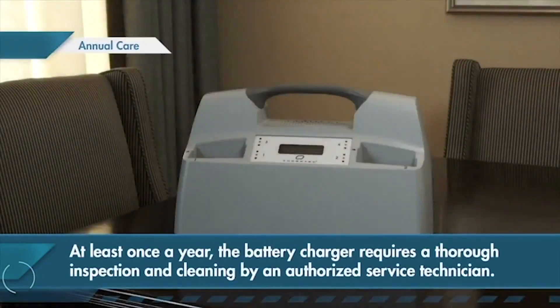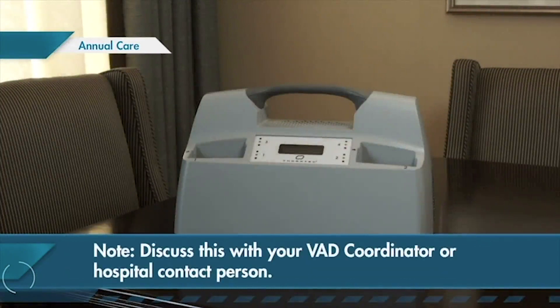At least once a year, the battery charger requires a thorough inspection and cleaning by an authorized service technician. Discuss this with your VAD coordinator or hospital contact person.